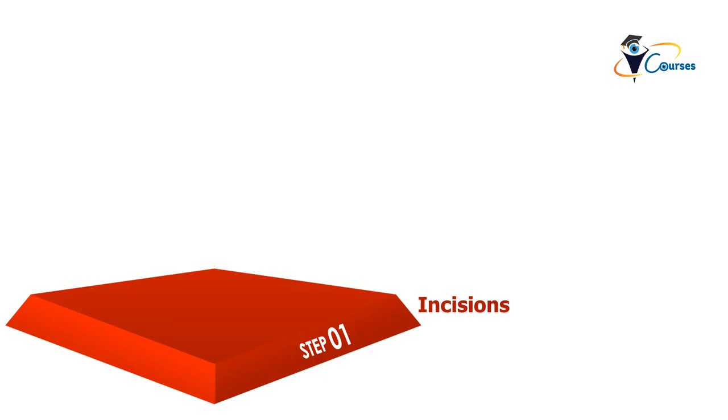For example, if you do the incision well, you will have a good, smooth, forward surgery. But if you made a leaky wound, then the iris will prolapse every now and then, and the anterior chamber will be lost every now and then if you have a large wound or a short or shallow wound. If you have a long wound, this can result in difficult manipulations.